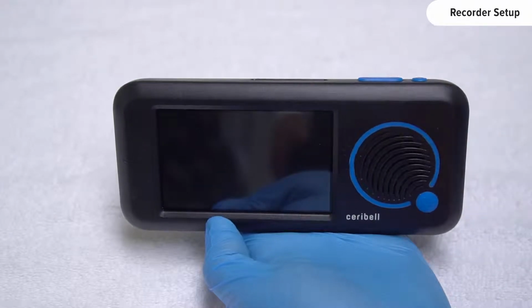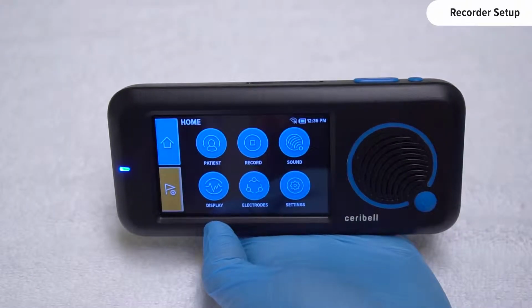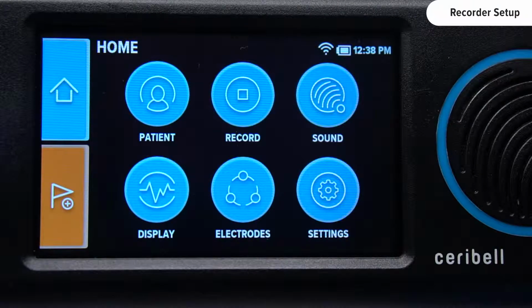Press the power button on top of the recorder to turn it on. If the blue LED is lit, the recorder is already on. A short press of the power button turns the screen on and off. The recorder is already configured, and there is no need to change any of the settings.